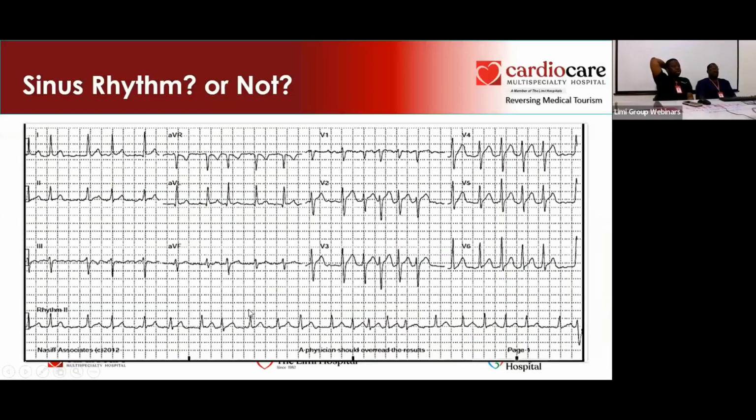This atrial fibrillation must be treated. You should recognize this. These people are at risk for stroke. They need to be seen by a specialist, and they need to get stroke prevention work done for them.